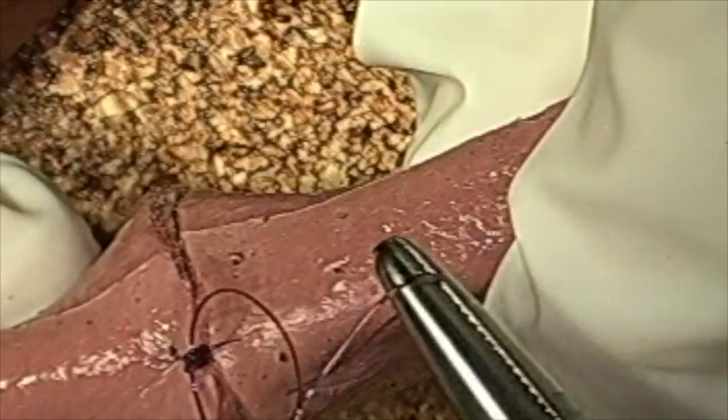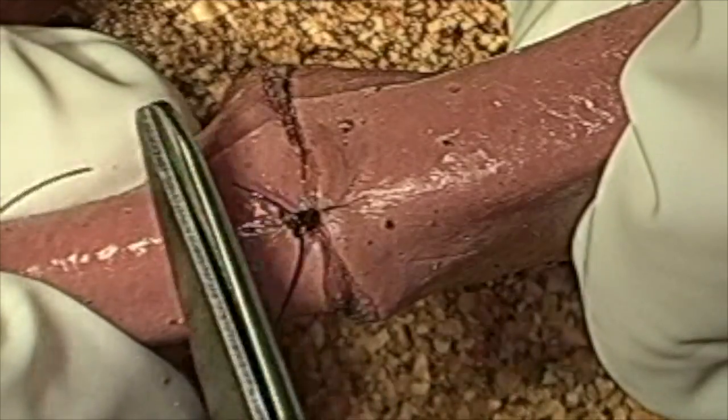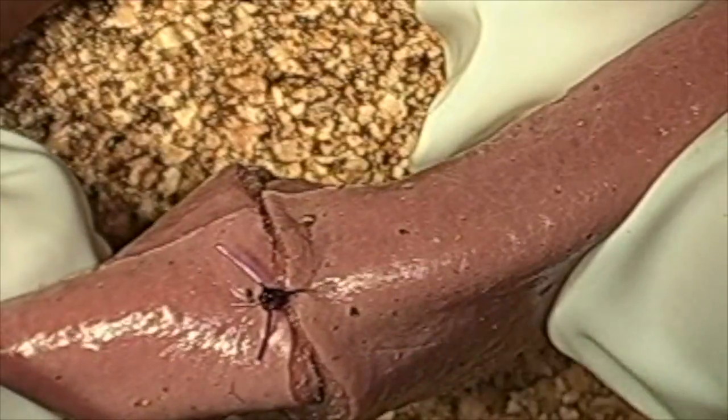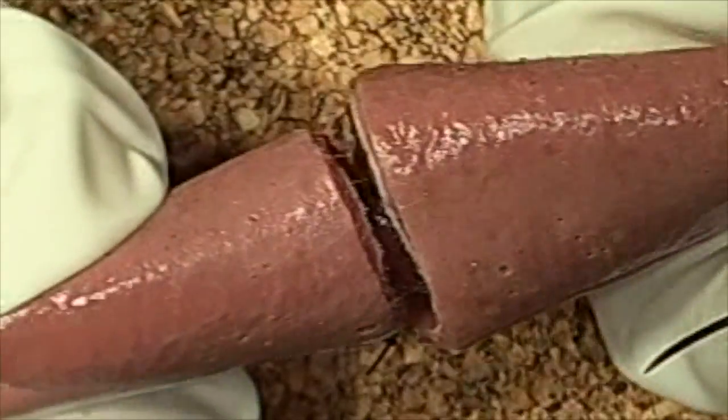Now, if this was the anti-mesenteric surface, we typically will sometimes put one suture there. If it was the mesenteric surface, we typically put three pre-placed sutures in that area first. We're going to pretend that's six o'clock, and then we're going to put a suture in at 12 o'clock now.